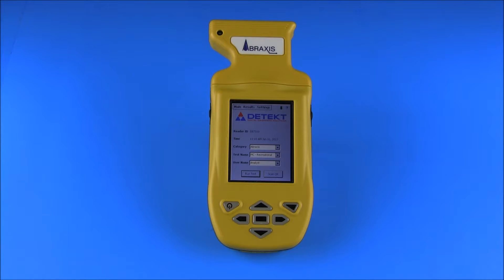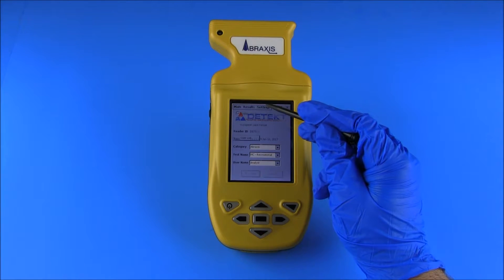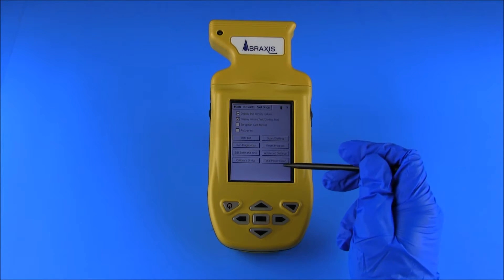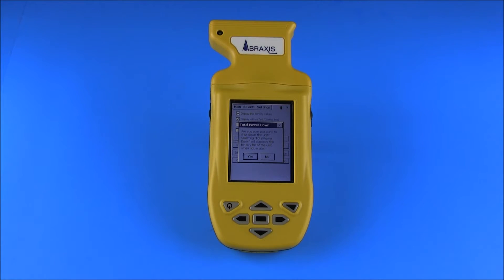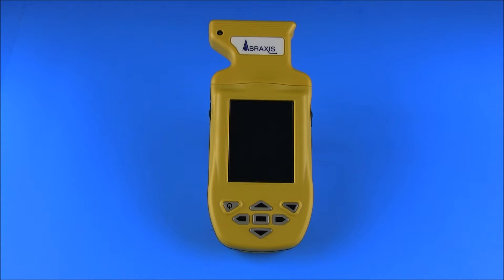For peak battery life and performance, the Total Power Down feature should be used when shutting off the reader after use. Total Power Down exits all programs, conserving battery life and ensuring that the unit recalibrates upon startup. To initiate the Total Power Down, use the stylus stored at the back of the reader to select Settings from the user control menu, then select Total Power Down and then Yes. Note that, unlike the Total Power Down, using the Power Off button will not exit the program in use — the program previously running will reappear when turned back on, continuing to deplete the battery. Total Power Down should be used rather than the Power Off button when there will be a significant waiting period between test strip evaluations.